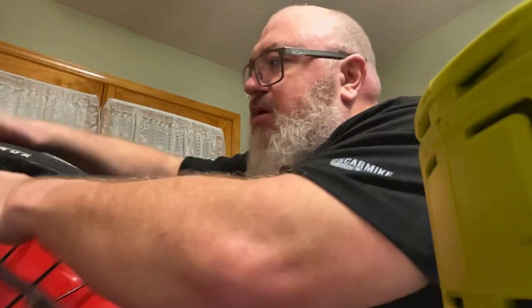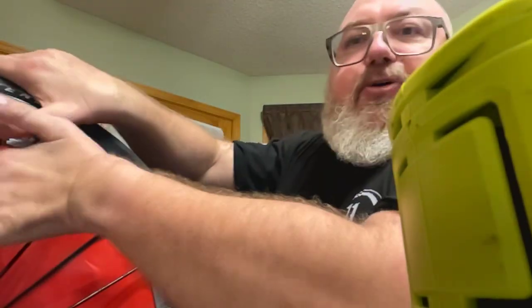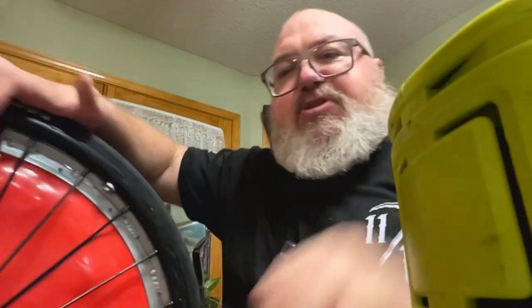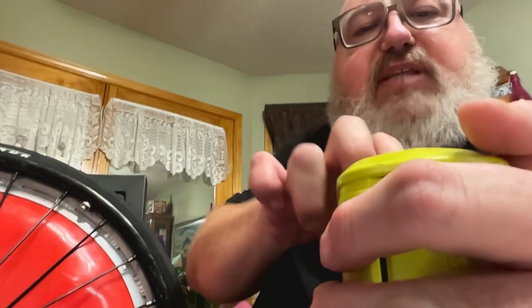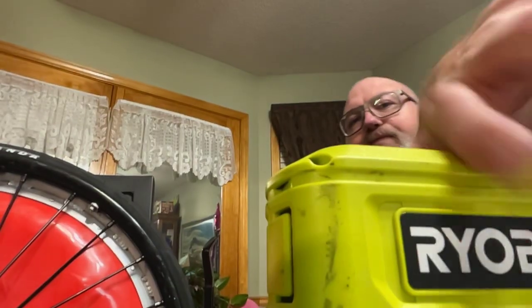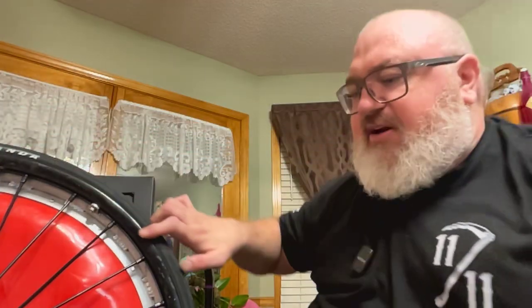So once we are rolling, so just got that tire changed. I'm only sweating a little bit, for the sweaters in the world. I am a neuromuscular quadriplegic, so it's going to get a little bit loud real quick. What I'm going to do is set this to 90 psi, hit play. It's going to make some noise. 33, 37, 39. I'm checking to make sure that my tube is not going to come out, and done.